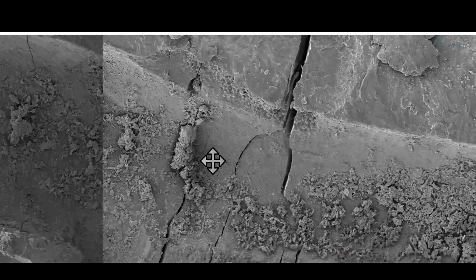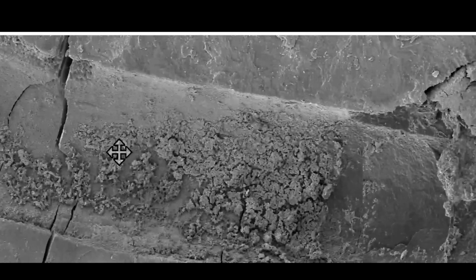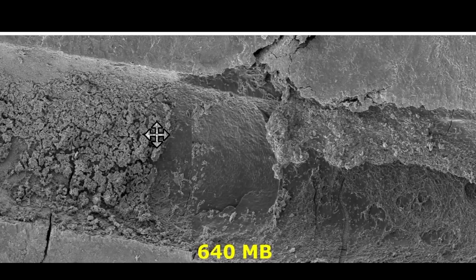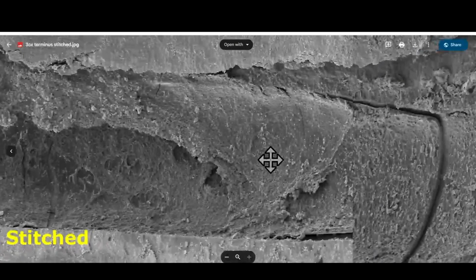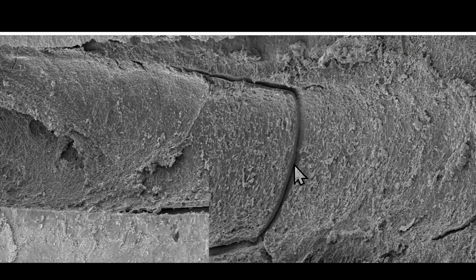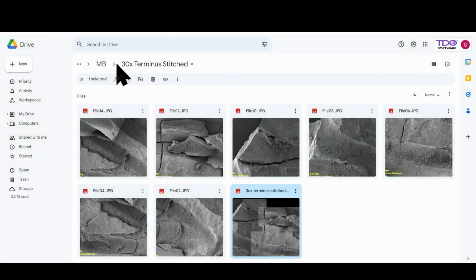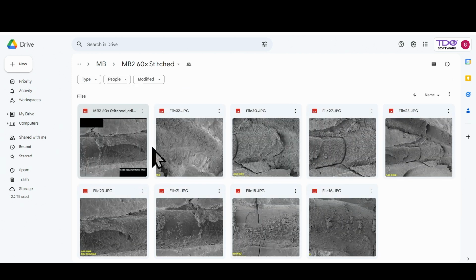This canal wall actually in some areas looks very, very clean. Not like Reed's other case with the Triton, which was much cleaner. And there you get a look at what some of the remaining pulp actually looks like. It's quite thick. The tissue left over had quite a bit of thickness.